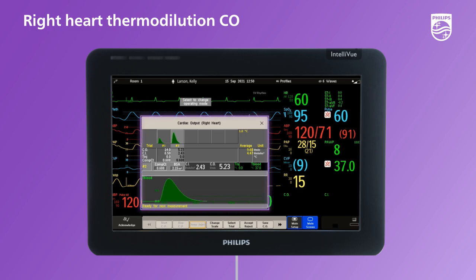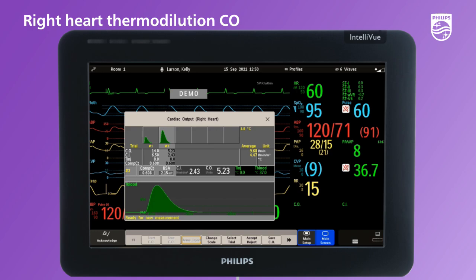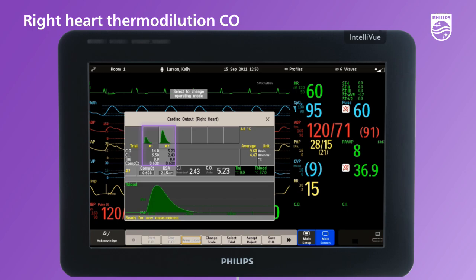The change in temperature in the bloodstream is used to determine the right heart thermodilution CO, and both the measurement curve and numeric are displayed. Since this technique is an aperiodic measurement and can be affected by multiple variables, more than one is performed to obtain an average CO value.